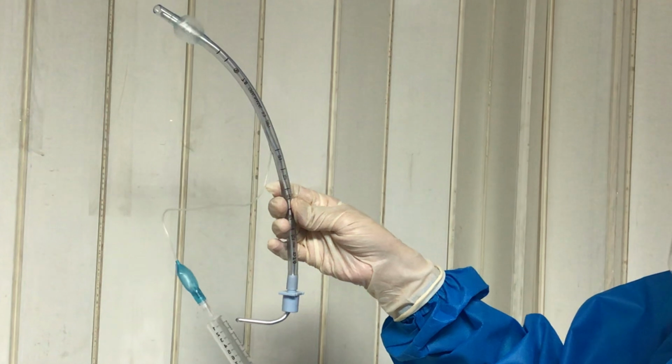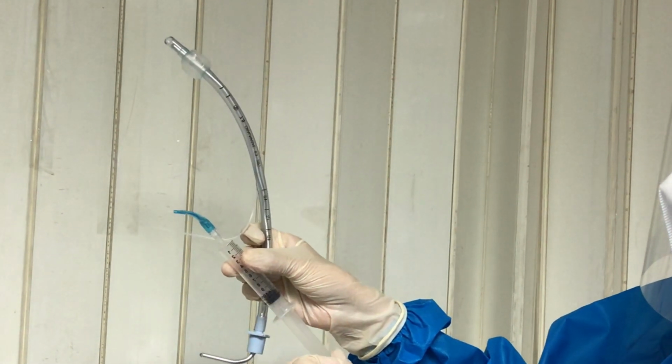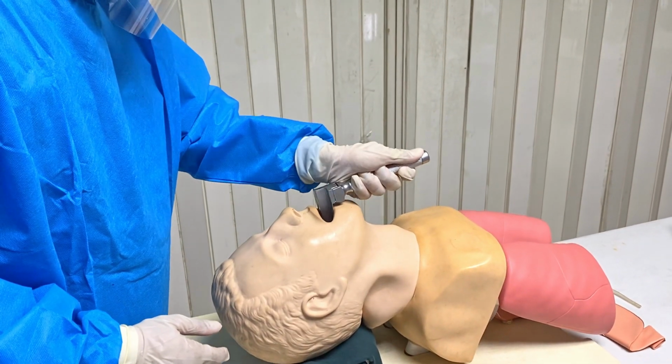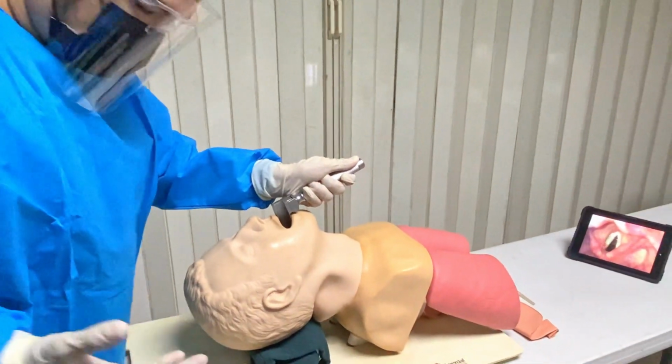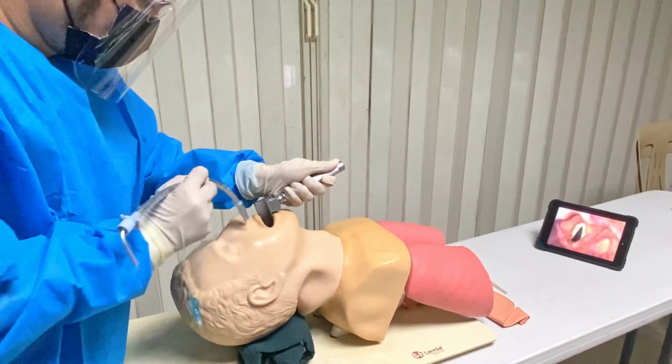For advanced airway, first make sure to check the patency of the cuff by inflating the pilot balloon and once confirmed, deflate. The laryngoscope is held in the left hand and inserted along the right side of the mouth, pushing the tongue to the left. Depth perception is difficult, and therefore structures should be identified as the blade advances past the tongue and epiglottis.